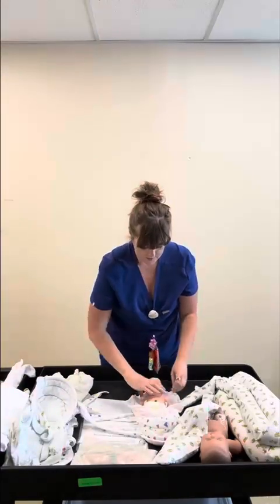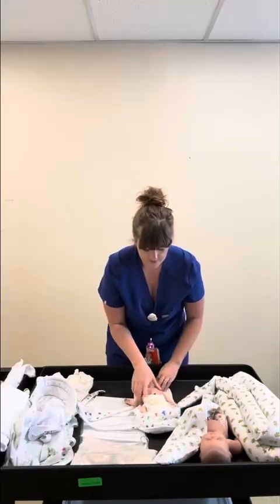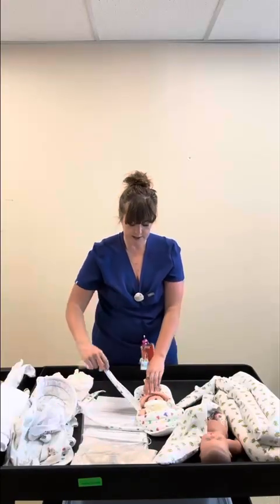So your baby no longer needs phototherapy. You can take them out of this Wombi pod, and you can still use the snuggle up, so their feet can get against here. Now you can use the straps. You still want to visualize their stuff.